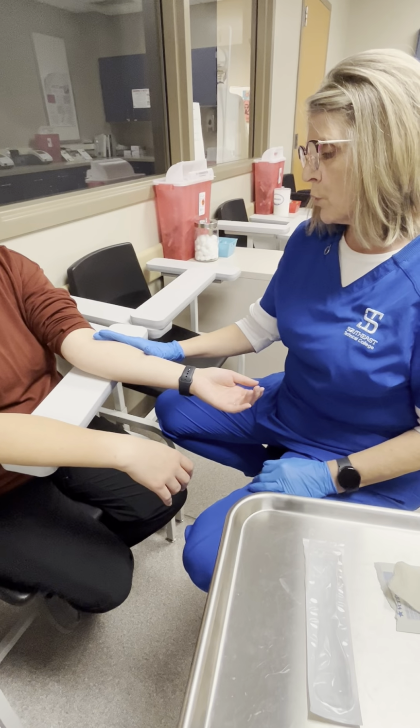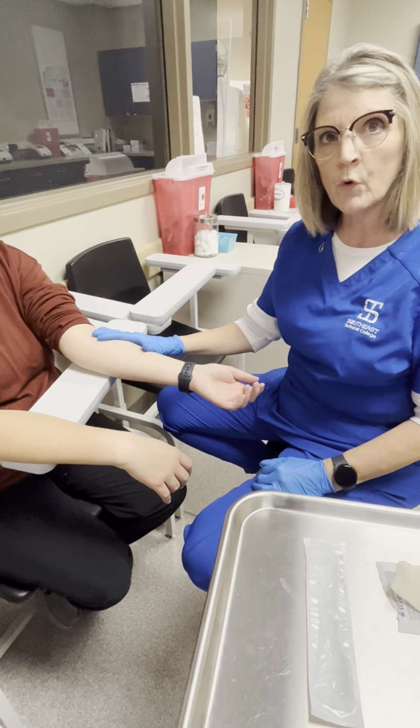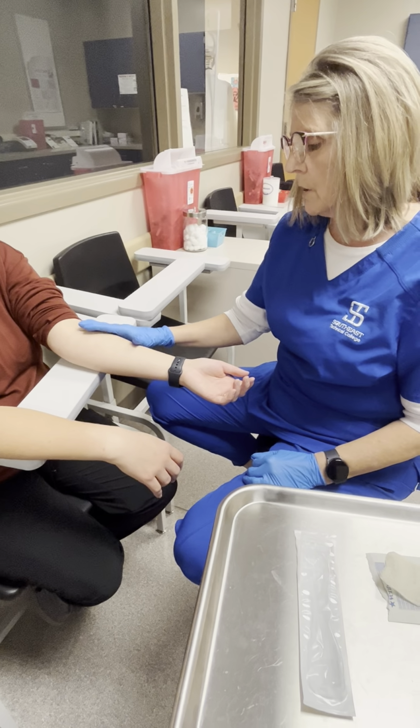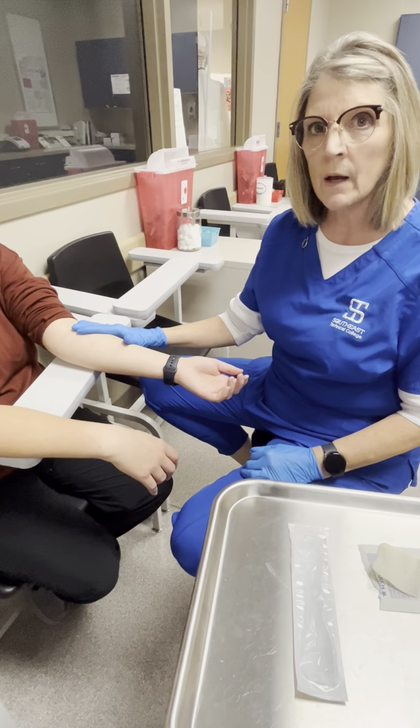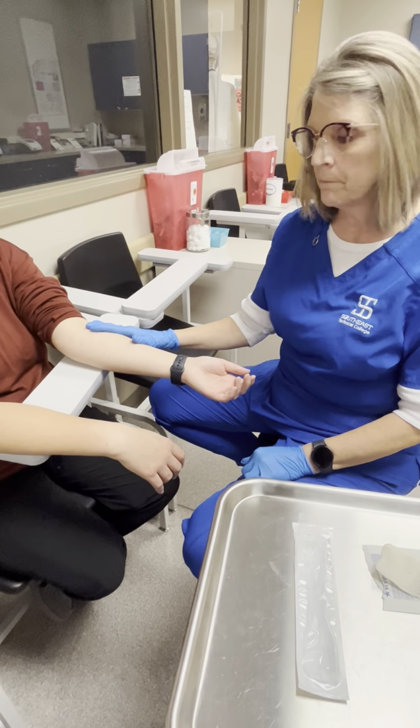And then most importantly, we need a commitment from the patient to return in 48 to 72 hours to read the result of this test. It's very important that we have that commitment from the patient to return.